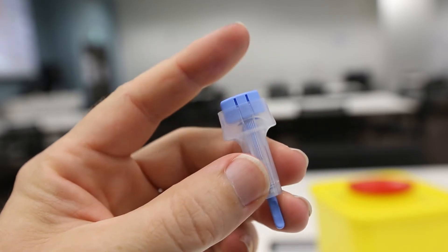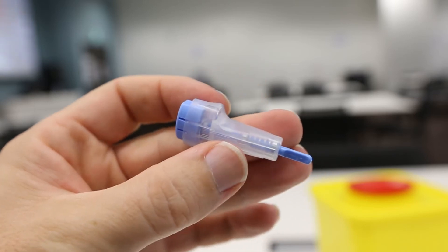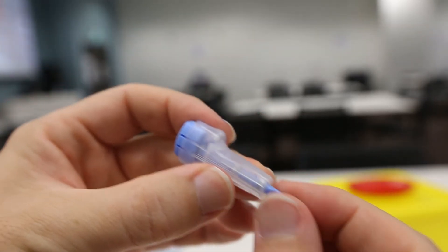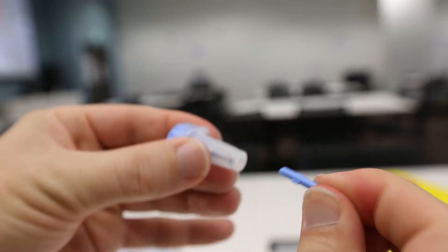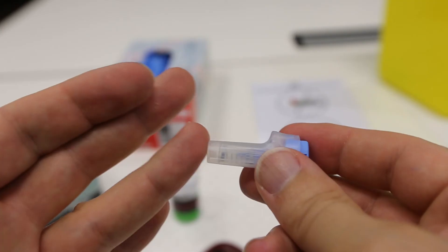Each lancet has a button on the top for discharging the needle. On the base there is a plug, which you simply twist and pull to remove the plug, ready to use the lancet.